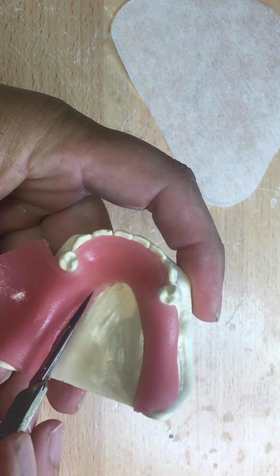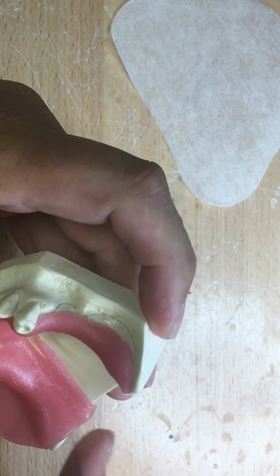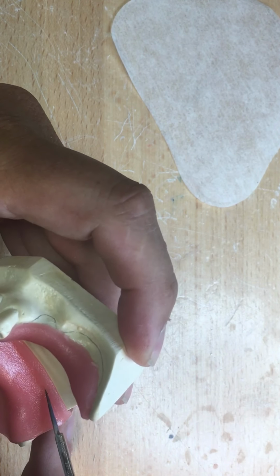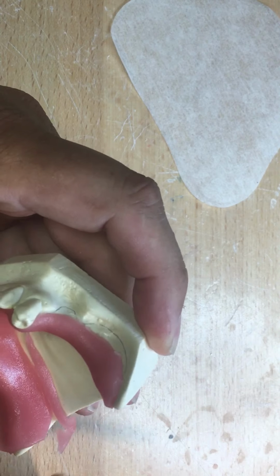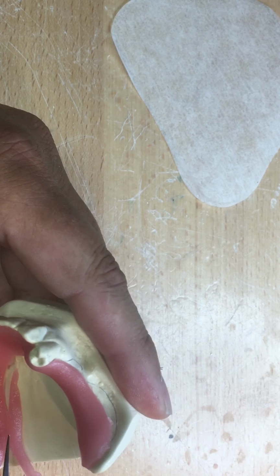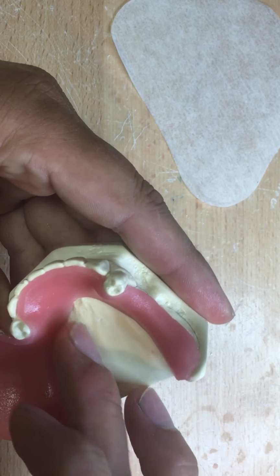Now, we talk dollars and cents. What's the occlusion rim? $35 to $45. Is that a career? I don't think so, but it is basically the loss leader of the cast partial dentures. This is a diagnostic tool that we're creating that is much needed.